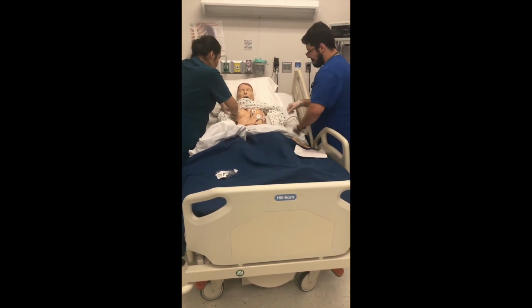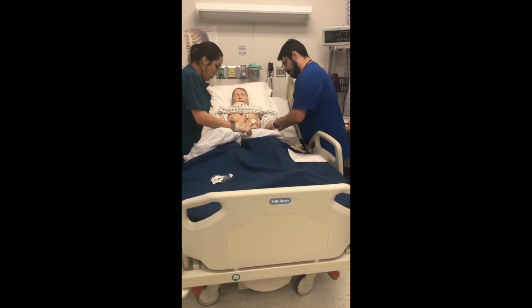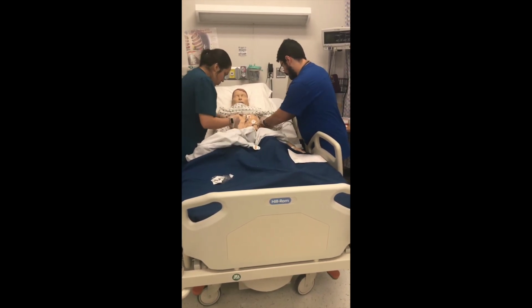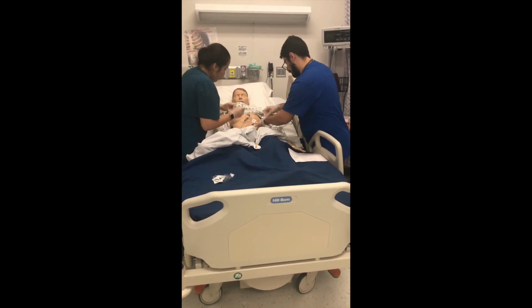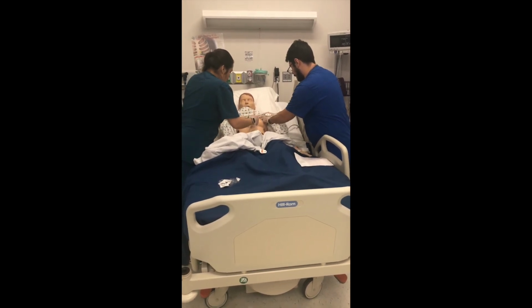When we have the report, we'll be placing the tracing copy in the patient's chart, and when the procedure is complete, we will lower bed to the lowest position, perform hand hygiene, and leave patients safe and comfortable. Complete documentation using forms, checklists, or electronic drop-down lists supplemented by nurses' notes or additional comments as appropriate.